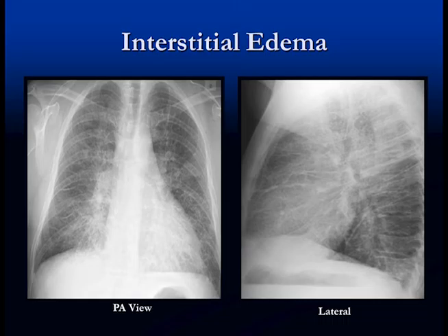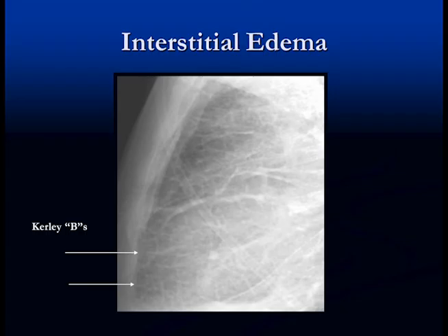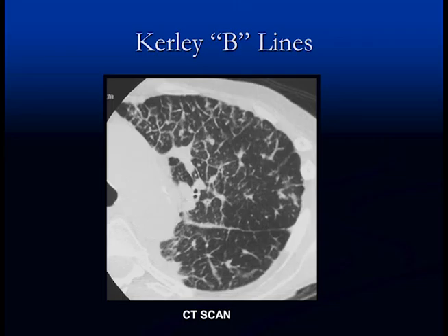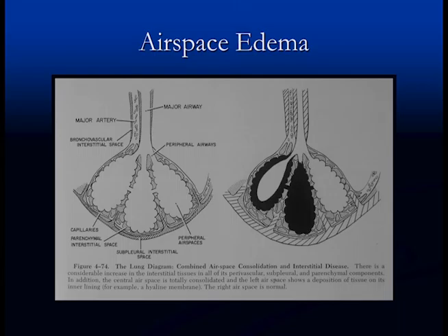In the lateral view we may also see small bilateral effusions with interstitial edema. To summarize the changes of interstitial edema: peribronchial cuffing, Kerley B lines, thickening of the fissures, small bilateral effusions, increased interstitial markings, and hila that are enlarged and indistinct. A blow-up shows the Kerley B lines as perpendicular lines where fluid tracks into the lung from the subpleural space — also visible on CT scan.